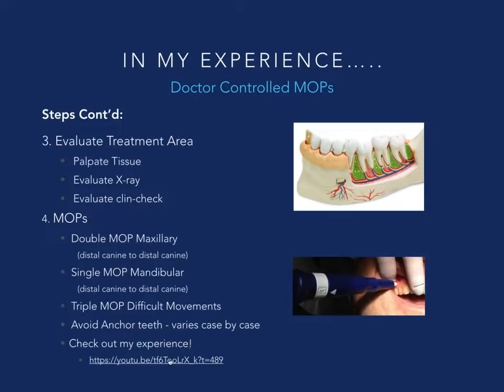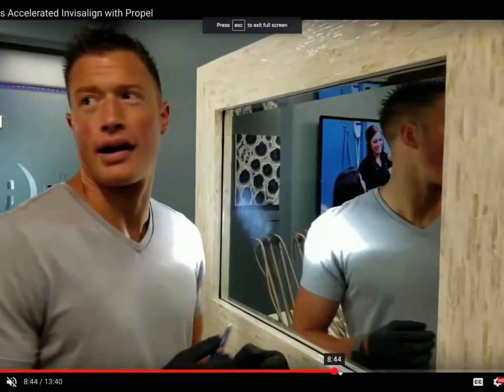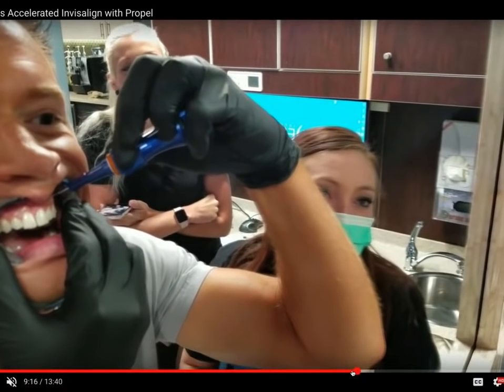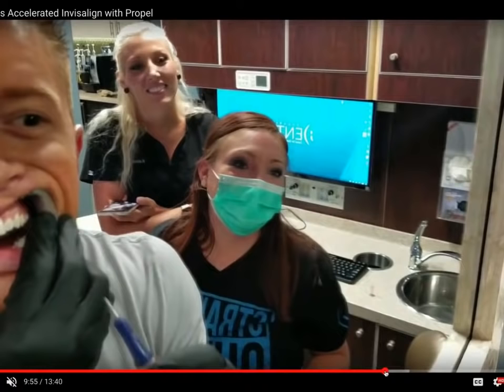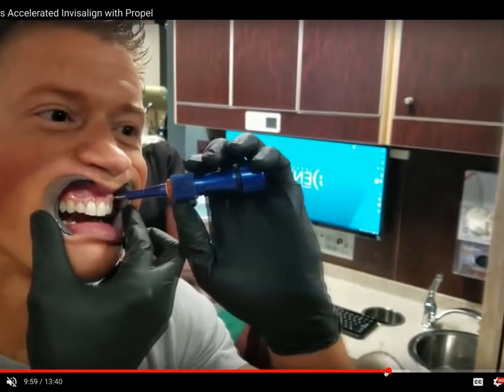And if you're wondering, earlier I showed you the video of the anesthetic being given to myself. If you're wondering who gave myself propel, I did. So this is a little interesting, right? You're going to perform propel on yourself. I've done hundreds of cases, and I was really curious what this felt like, what it felt like to be numb that much, what it felt like to feel the device enter the tissue and the bone, and get an insight into what my patients were going through, so that I'd feel confident about my recommendations and what I was saying would be their side effects, if any.